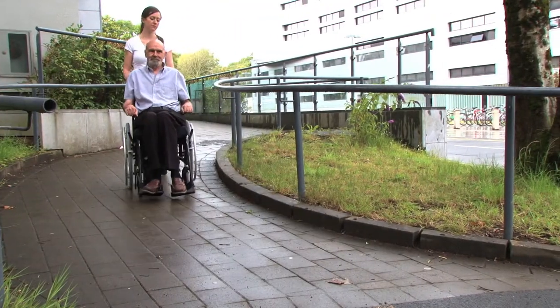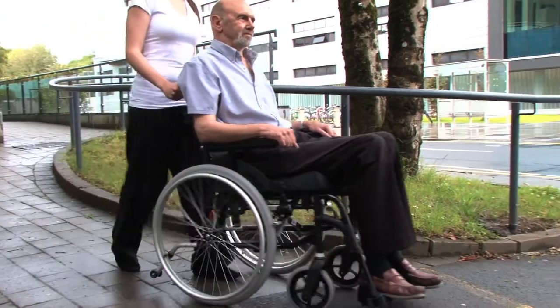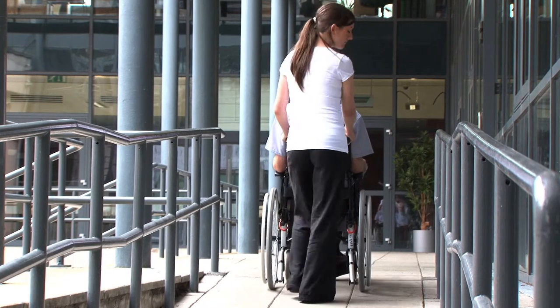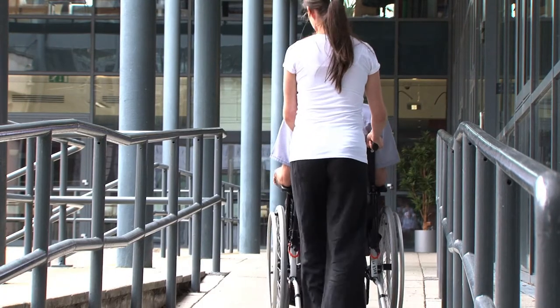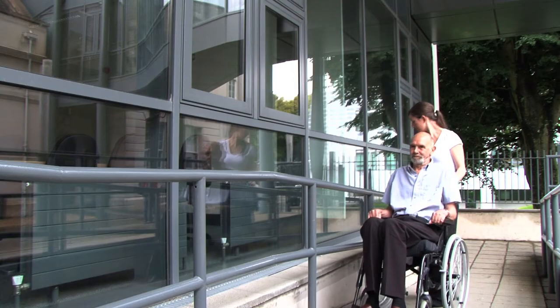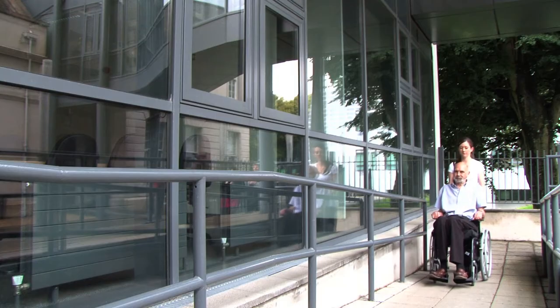When going down an incline, the caregiver holds the handles firmly and allows the wheelchair to roll down. If the incline is very steep and the caregiver doesn't feel comfortable, they can descend backwards. This will prevent the chair from running away and avoids the possibility of the wheelchair user being tipped forward. Remember to watch for obstacles if descending backwards.